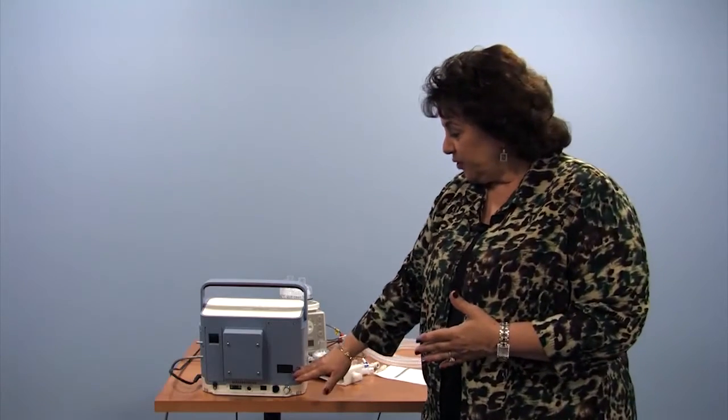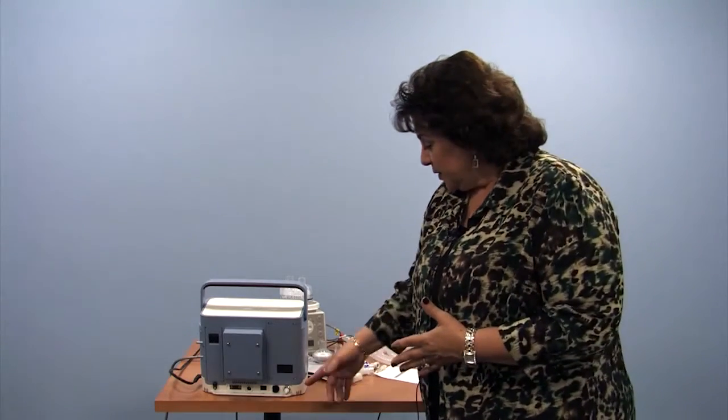My preference would be that the physician order a range for you. Oxygen for your particular child could be 0 to 4 liters per minute into the Trilogy ventilator so that you achieve a saturation on your oximeter or saturation monitor between, say, 92 and 95%. Each prescription will vary depending on the child's needs. So that the fact that you have 0 at one end means that if your child's oxygen saturation is high enough and meets criteria for the prescription, you can turn the oxygen off.